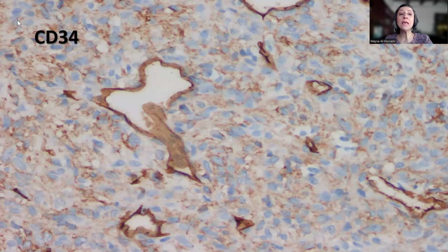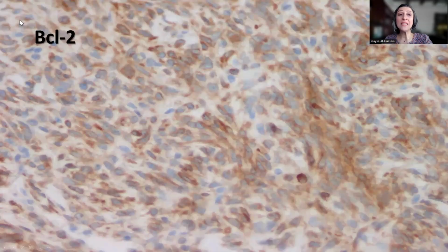Now, previously, before the era of STAT6, we used to depend on other immunohistochemical stains, one of which was CD34. And CD34 tends to stain the normal vessels, and this is another staghorn vessel, but also the tumor cells. And there is some granular membranous to cytoplasmic staining in the tumor cells, which would be interpreted as positive staining. BCL2 was also beautifully positive in the tumor cells, and this is one of the stains that we used previously to support the diagnosis of solitary fibrous tumor.